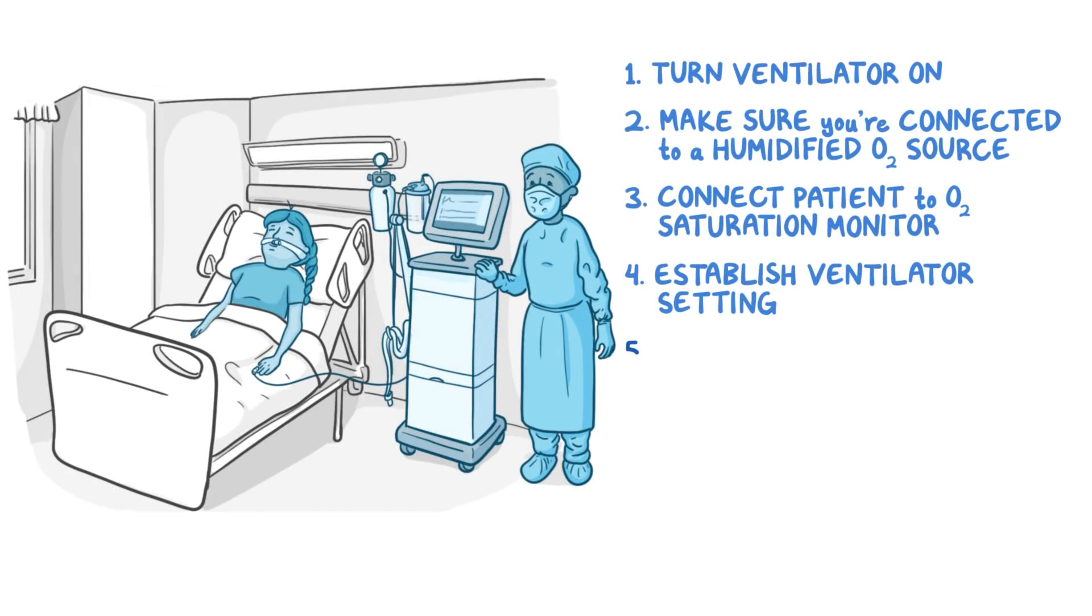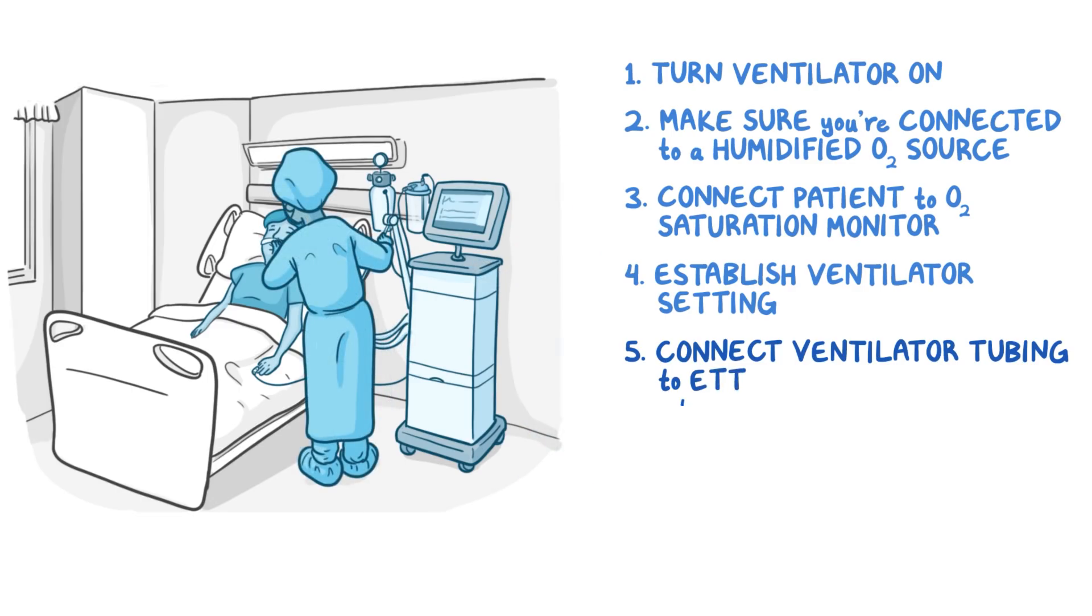Okay, now that we've established our ventilator settings, we're ready to connect the ventilator tubing securely to the end of our endotracheal tube. Ensure the patient is comfortable with optimal sedation and analgesia prior to connecting and suctioning their airway to ensure patency.